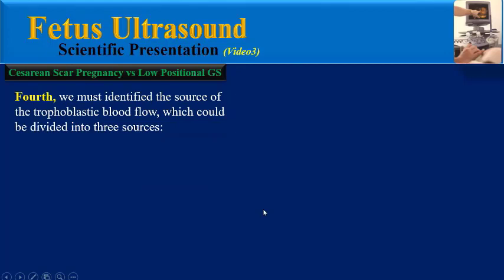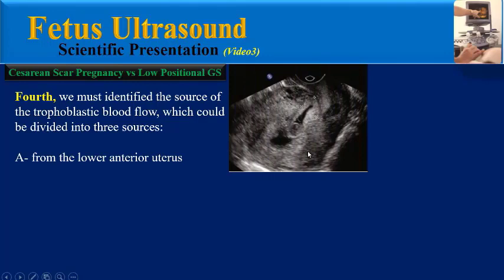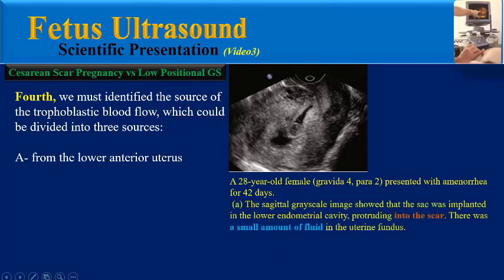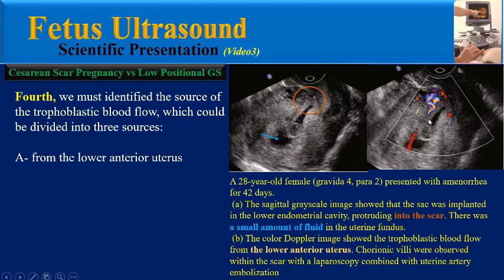In the next step, we must identify the source of the trophoblastic blood flow, which could be divided into three sources. The first source is from the lower anterior uterus. As an example, in a 28-year-old pregnant female, the sagittal grayscale image shows that the sac was implanted in the lower endometrial cavity, protruding into the scar, with a small amount of fluid in the uterine fundus. In the color Doppler image, the trophoblastic blood flow from the lower anterior uterus is determined.